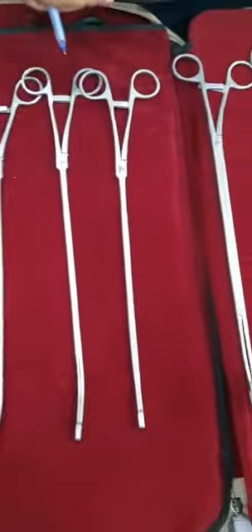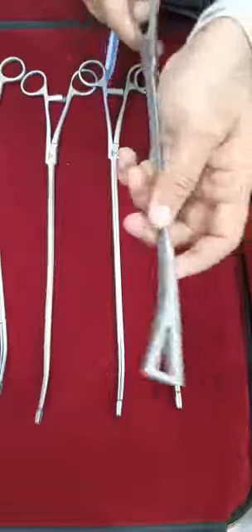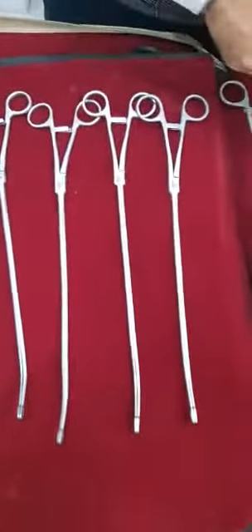Then another one which we are having is in 24 mm triangular ring, which is going to be used once again for holding the lungs. Both can be used for holding the lungs.